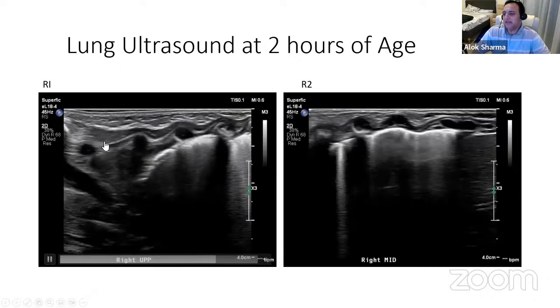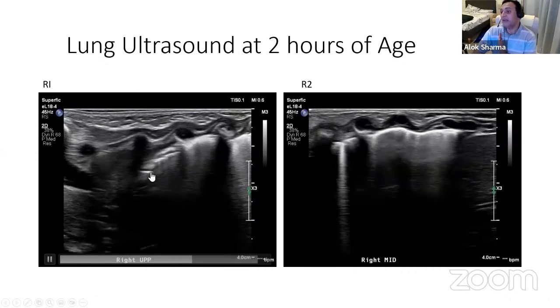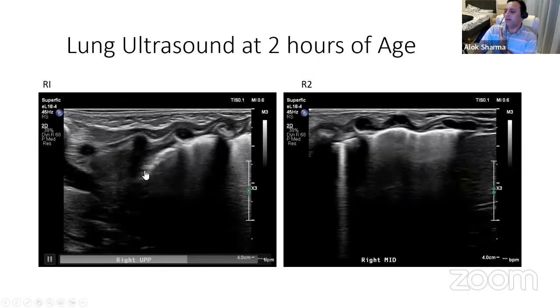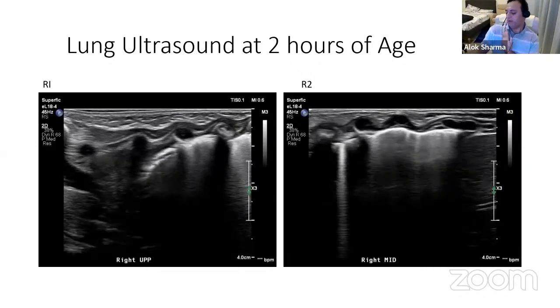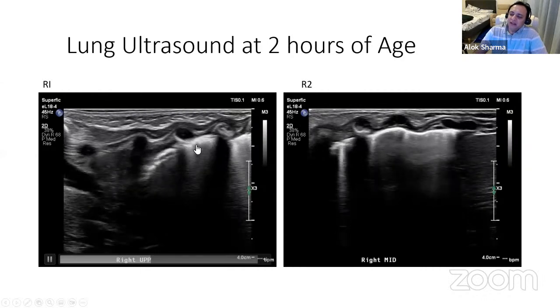Some of that is because the alignment of the probe is not great. You can see how the ribs slide down a little bit, so you probably want to correct your alignment. The way to correct your alignment on the right side, if you're struggling and using a linear probe, is to direct the linear probe a little more and have better contact. Or just put a shoulder roll under the baby, which will help delineate this area much better. I'd probably agree with you that this is a very dense coalescent B-line, and I do think that the pleura, even with the nature of my image, shows an element of subpleural consolidation.